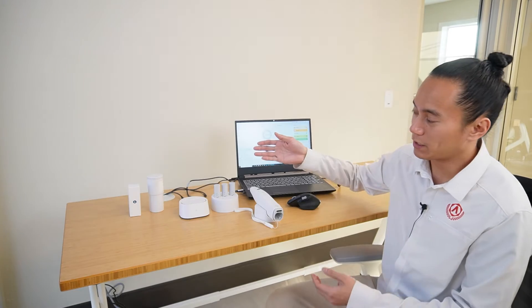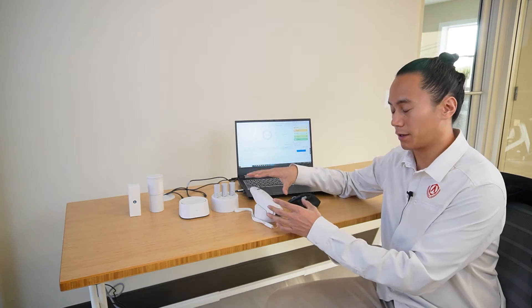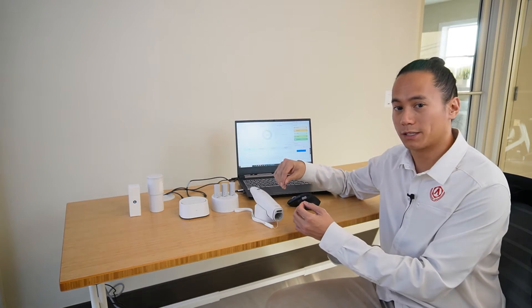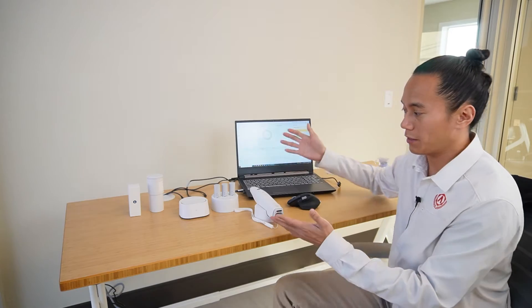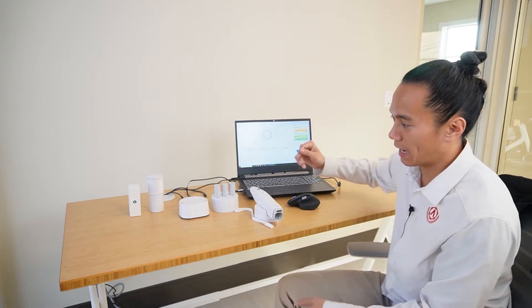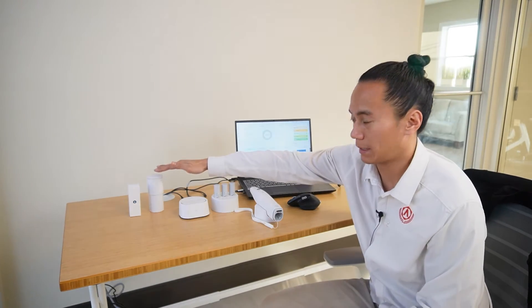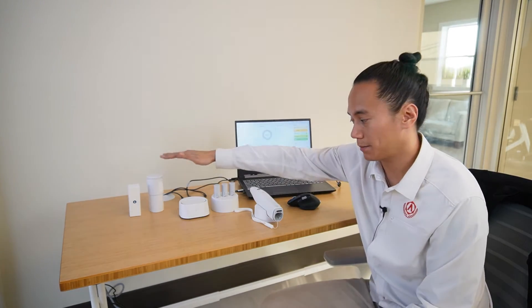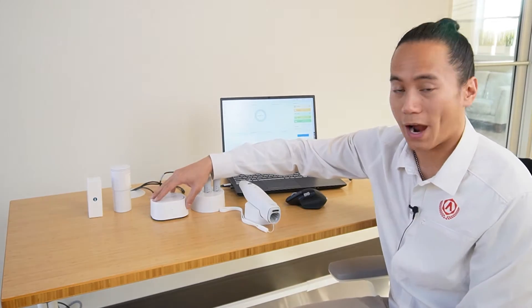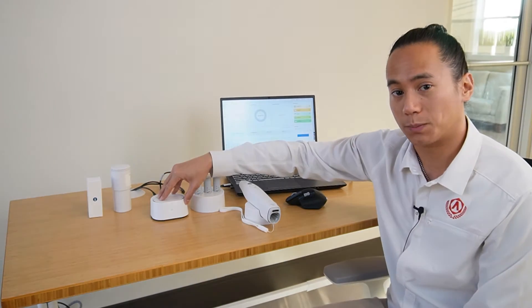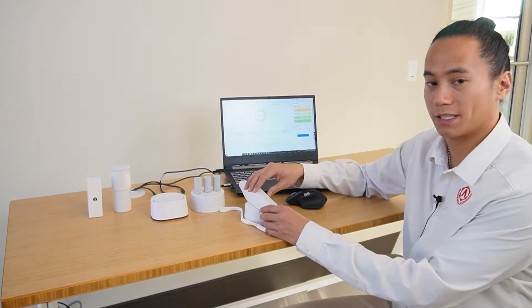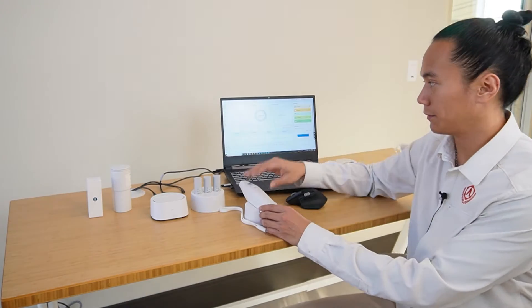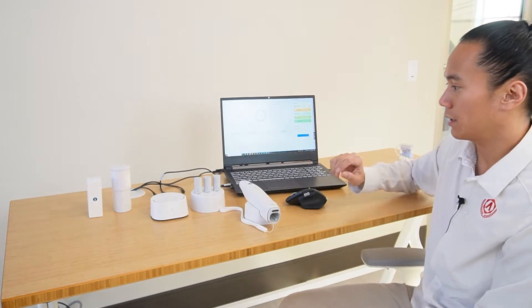We're going to quickly go over the completely wireless setup and workflow. On the table, we have our scanning tip, calibration tip, your wireless USB hub, your charging station, the scanner itself, and of course your workstation here.